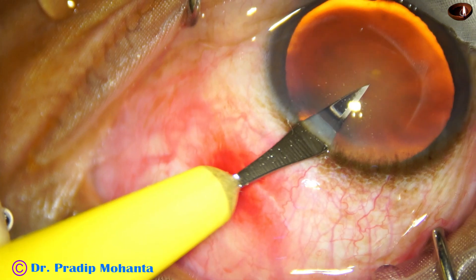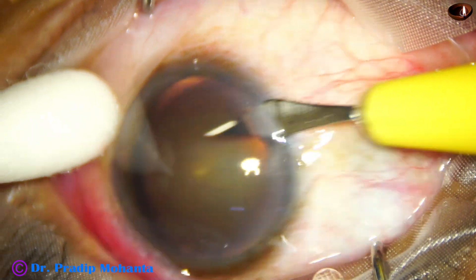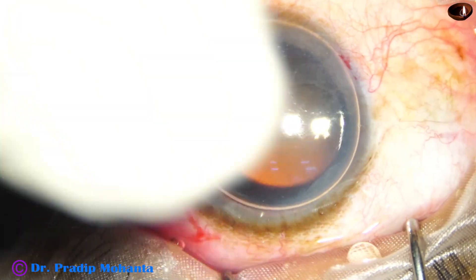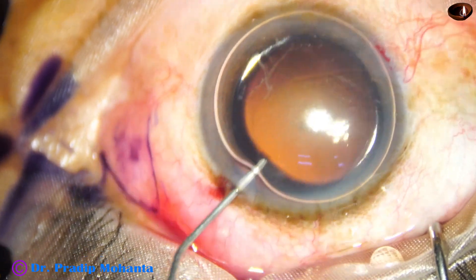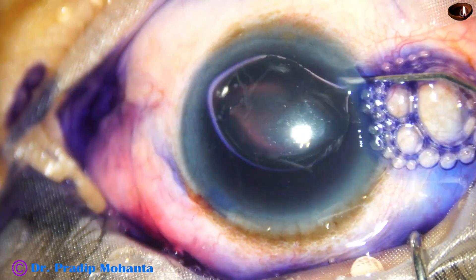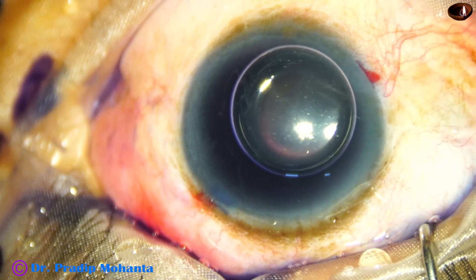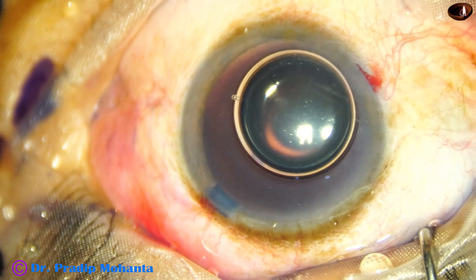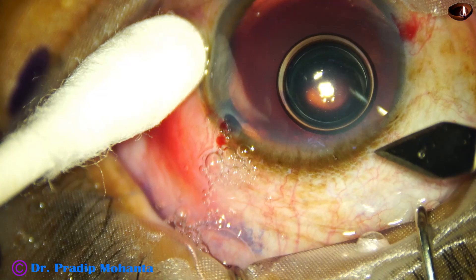First do the side port, because leakage of aqueous humor is less if you do the side port first. If there is not much leakage you can do both side ports, and now inject an air bubble. Beneath this air bubble inject trypan blue dye — the dye should touch all parts of the anterior capsule. You can inject a little bit of adrenaline to maintain the dilatation of the pupil. If the side port is very small, just keep injecting BSS and most of the dye will come out.